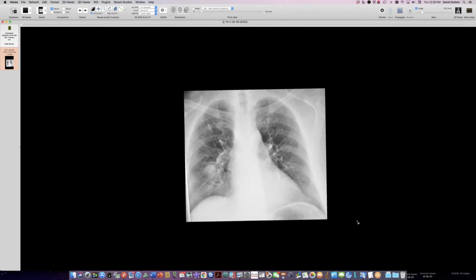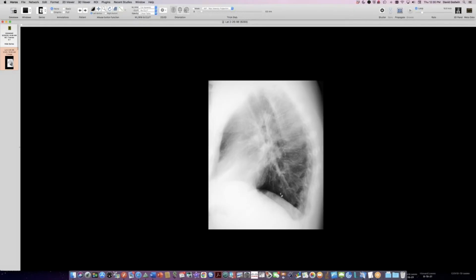And here's a 51-year-old man who is a totem pole carver. He's an Alaska native, and he came in with fever, shortness of breath, and has a fairly compact pneumonia in his right base here. And it's hiding in here. We have a previous chest lateral radiograph that shows clearer vessels converging toward the hilum here. And in this case, they're smudgy. So the previous radiograph makes it easier to detect this pneumonia in this location.